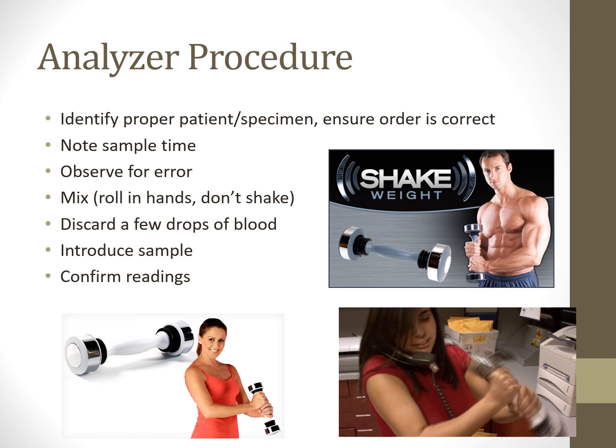I've seen a student do that before when I was precepting them. We drew a blood gas and they decided to shake it, and they said they were told to shake it. I'm like, no, you were never told to shake it. I'm pretty sure it's a roll in the hands thing. Do not shake weight it, right? No shaking. So this mixes it with the heparin that's in there.